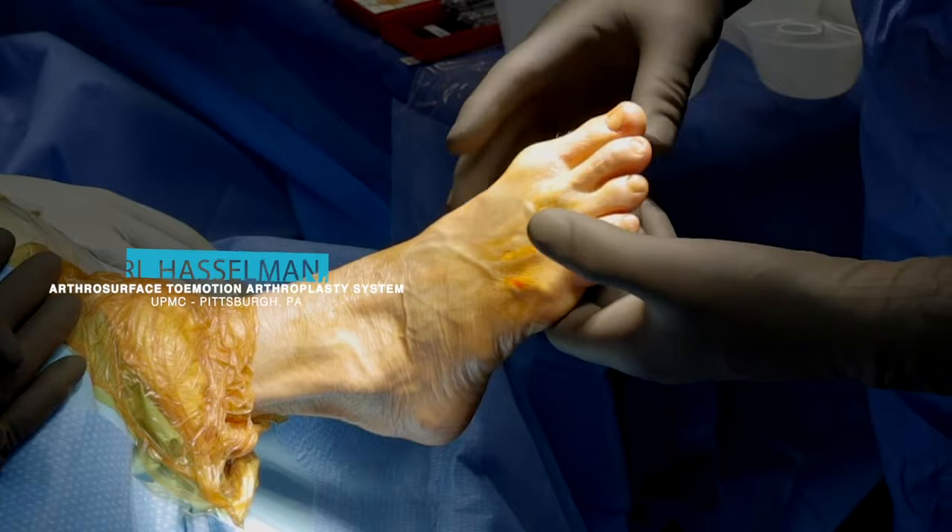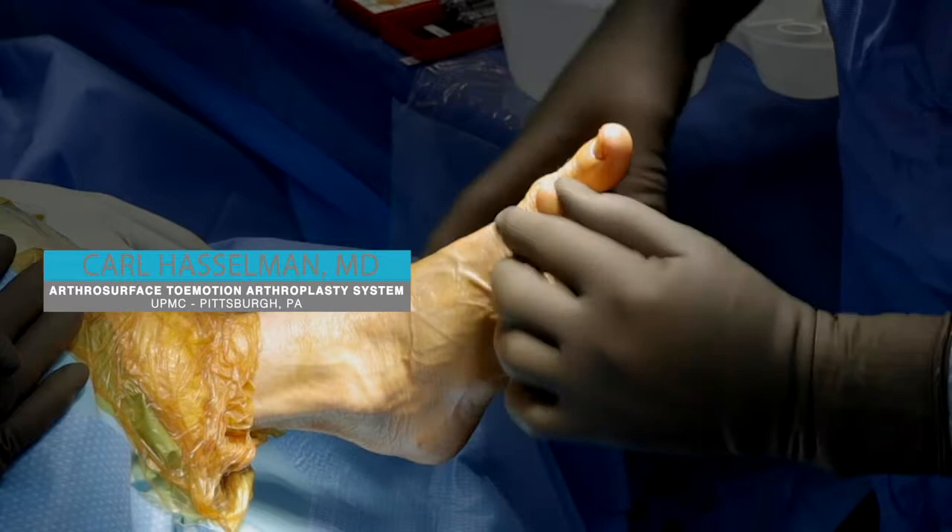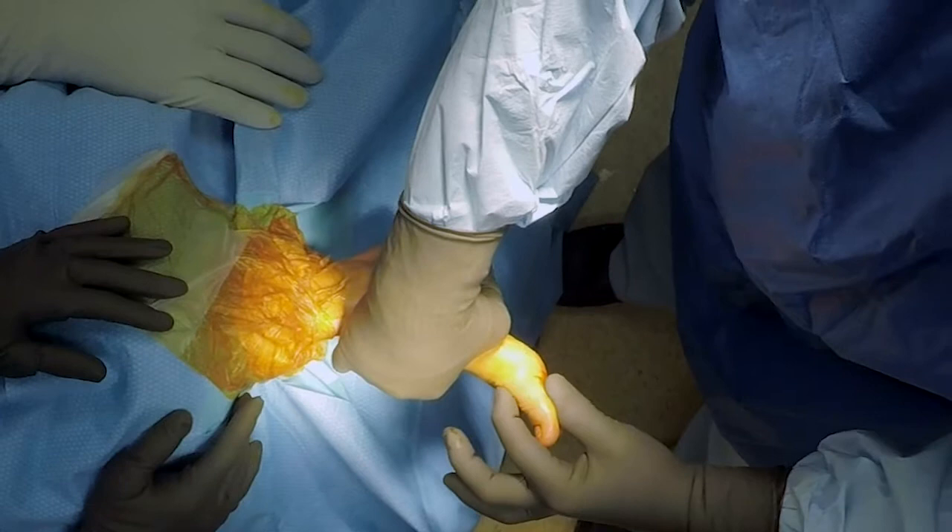Classic Hallux Rigidus with swelling around the MTP joint. If you look, dorsiflexion of the other toe is 90 degrees. This one is limited to less than about 50 degrees. Classic findings.